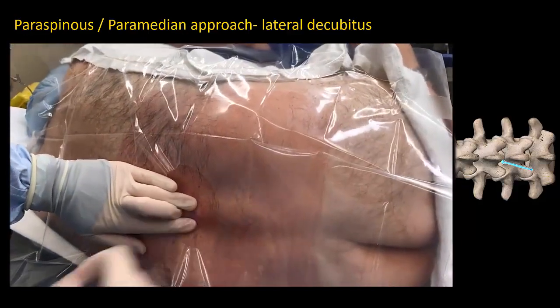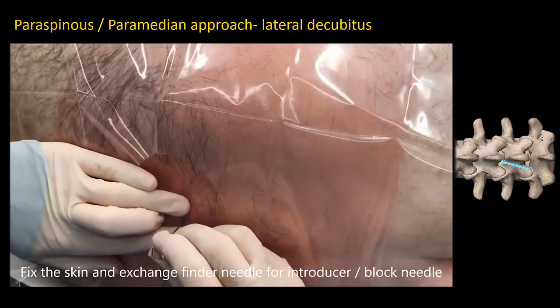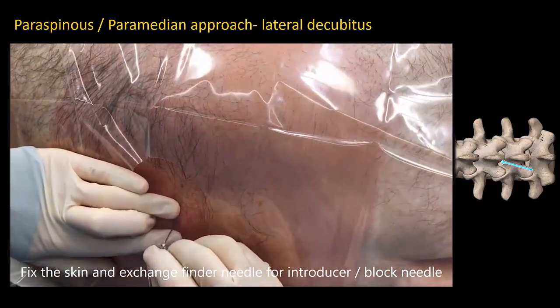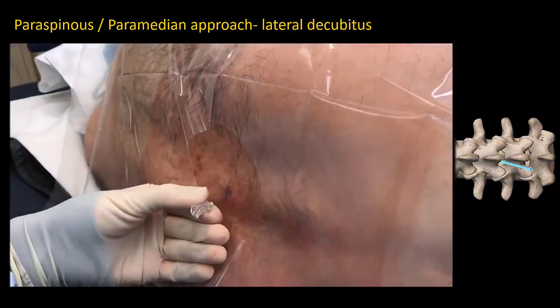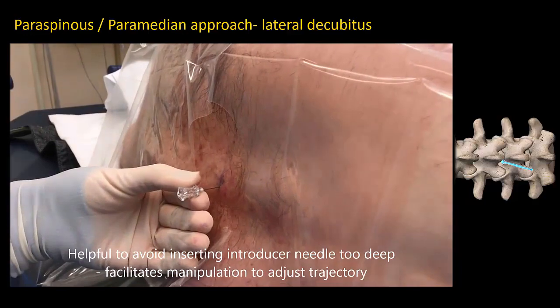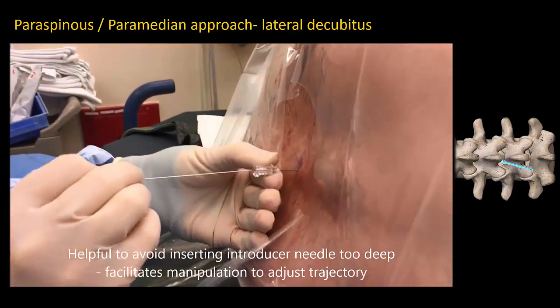Fix the skin and exchange the infiltration needle for the introducer or spinal needle. With an introducer, I tend to only insert it halfway so that it can be easily manipulated to guide spinal needle redirection.